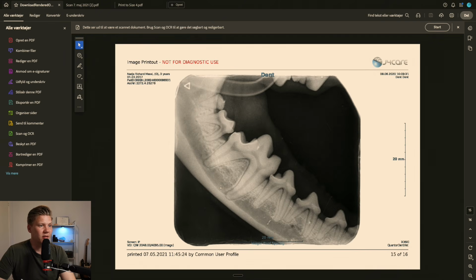And that's all the x-rays. So I hope this walkthrough was useful in how to look at dental x-rays, what to think about when you open the mouth in a dog, and look at the signs that you see.